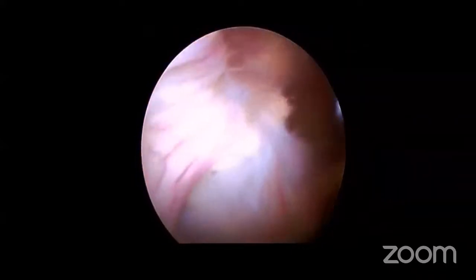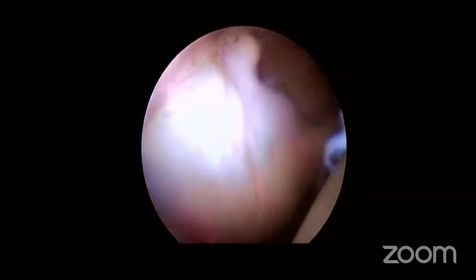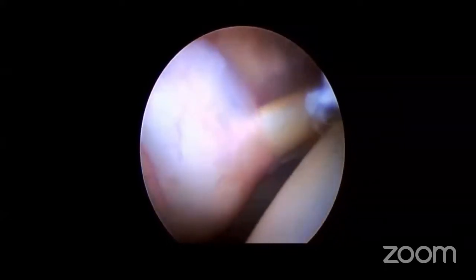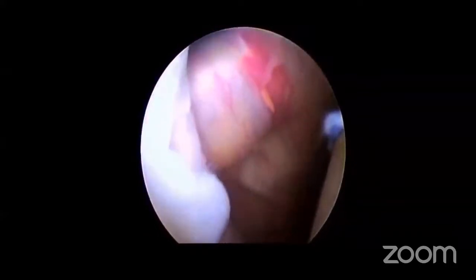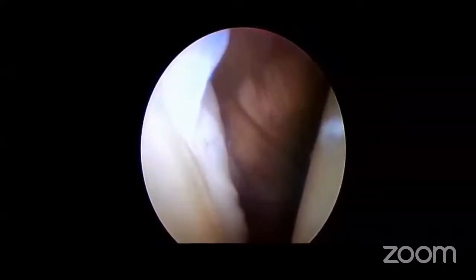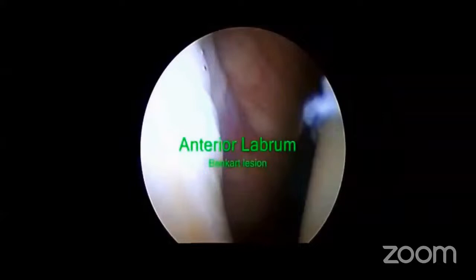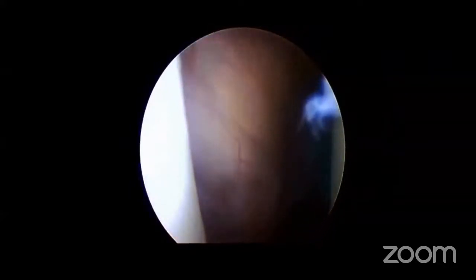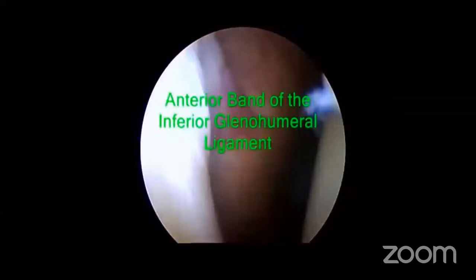Again, as you slightly withdraw your arthroscope and bring the glenoid into vision, you start seeing the middle glenohumeral ligament, which is a band which runs across your subscapularis tendon. And then this is where you start seeing the anterior labrum, where you would be able to appreciate any labral lesions or any Bankart lesion. And as you again move your scope inferiorly, you start seeing the anterior band of the inferior glenohumeral ligament.